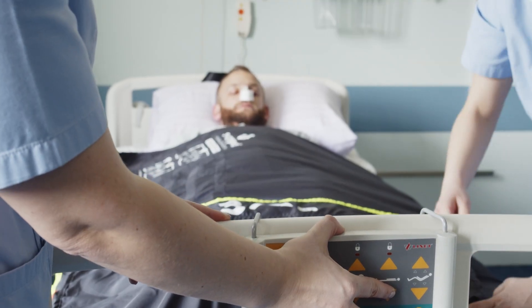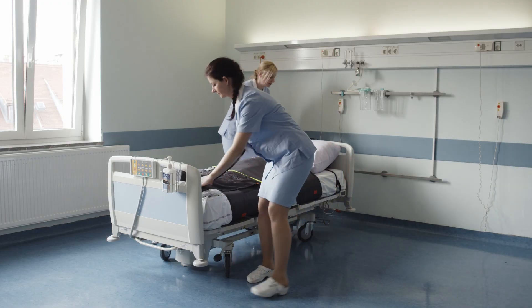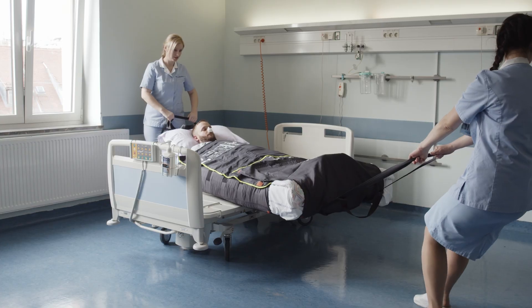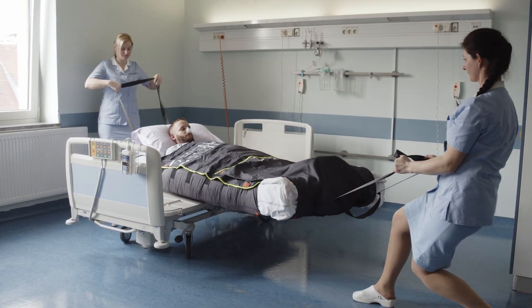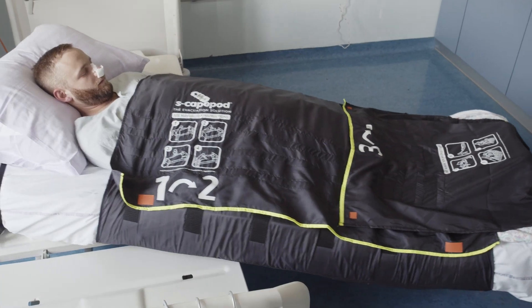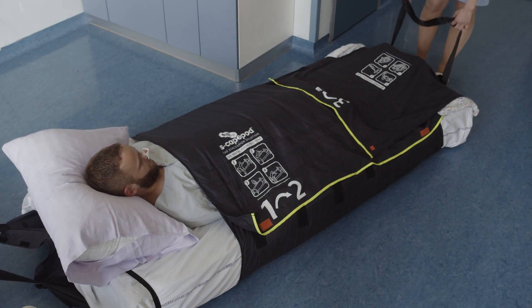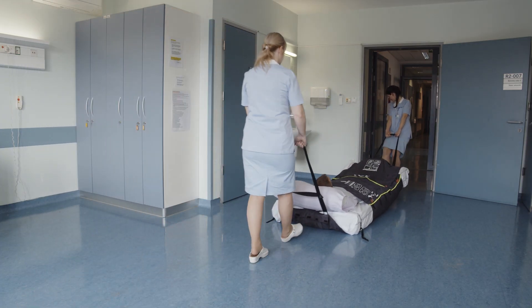Pull the underside from under the mattress and use it to tightly close the part at the feet. If the bed is adjustable, move it to the lowest possible position. Hold the strap firmly at the bottom of the evacuation mat and slowly turn the mat with the patient at the angle of approximately 80 degrees relative to the bed frame. Hold the mattress horizontally as you gently pull it out of bed. Lower the mattress slowly with the lowest part of the patient above the bed frame. Pull slowly until the patient is lying on his or her mattress. Evacuate the patient by pulling the evacuation mat. Stand upright and use your own weight when pulling.